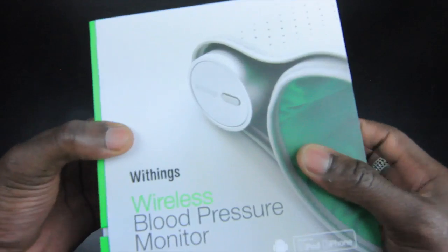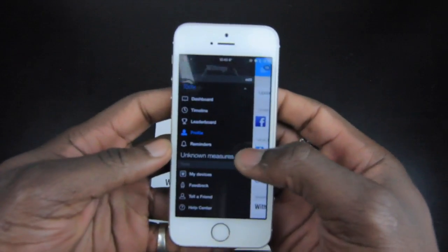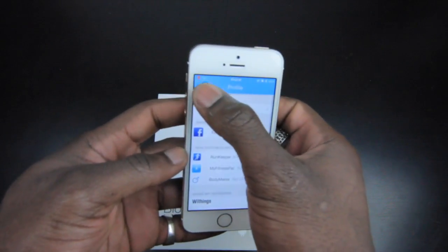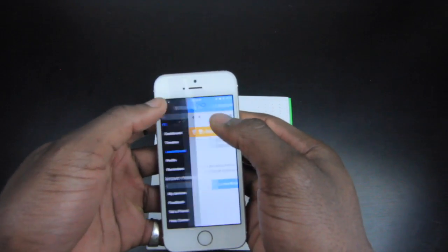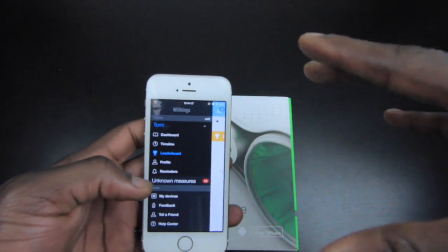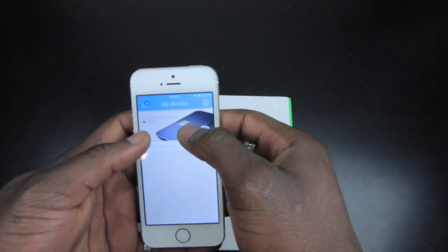Let me quickly show you the iPhone app so you can see what the dashboard looks like. You get your dashboard with your profile where you can send information via email, and you can also hook it up to Facebook. There's also a leaderboard feature — if you've got other Withings products like the scale and similar devices, you can have different users and see who's doing well.